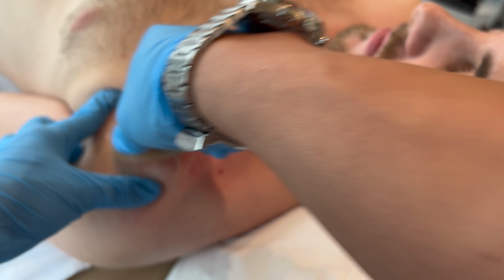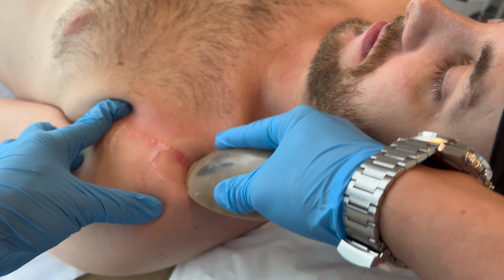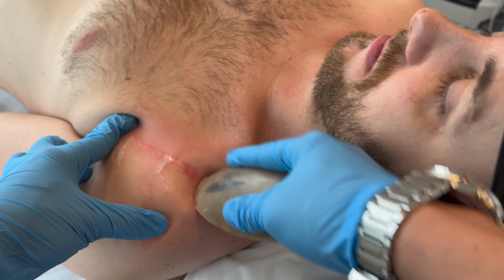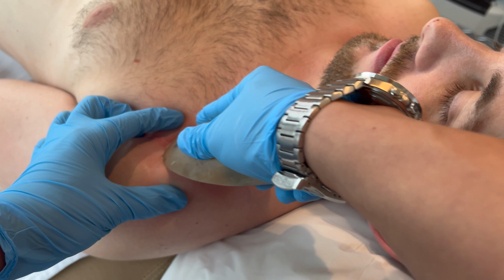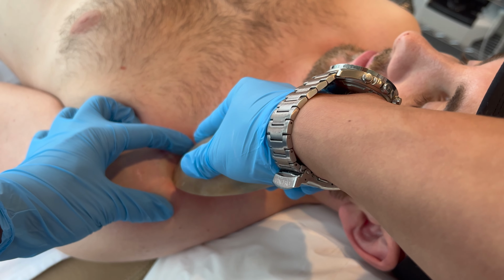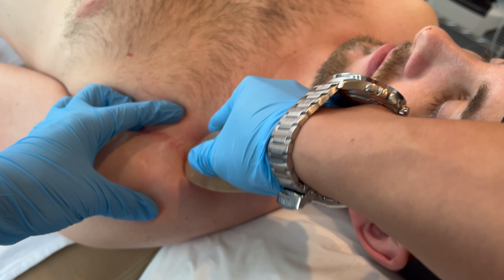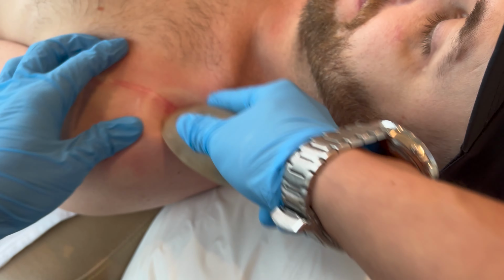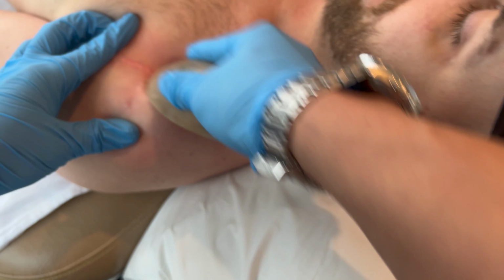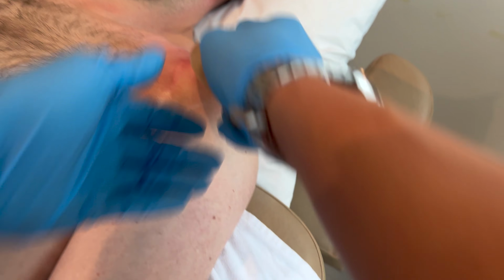I didn't expect anything that can be felt abnormally, but here I can feel some sandpaper-like texture. So I'm going to go a little bit harder, go up to the epidermis layer, apply more pressure and create more traction to it. That feels okay? Yeah. Okay. That looks like a pretty good warm up there.